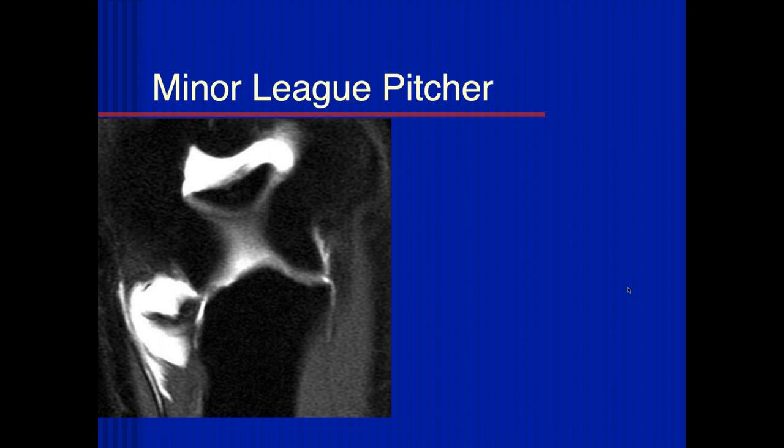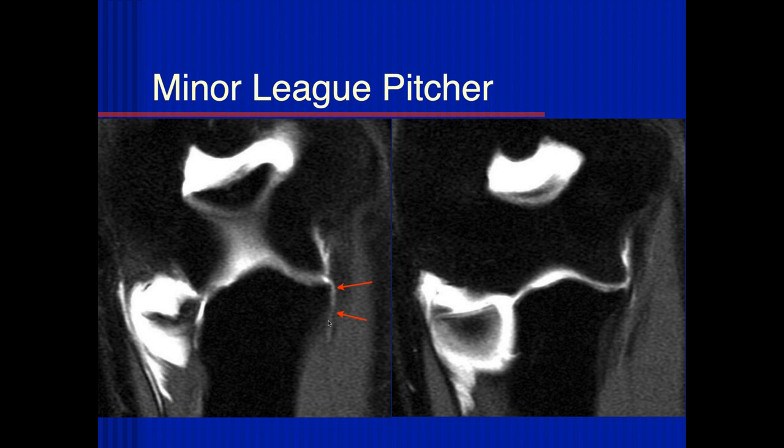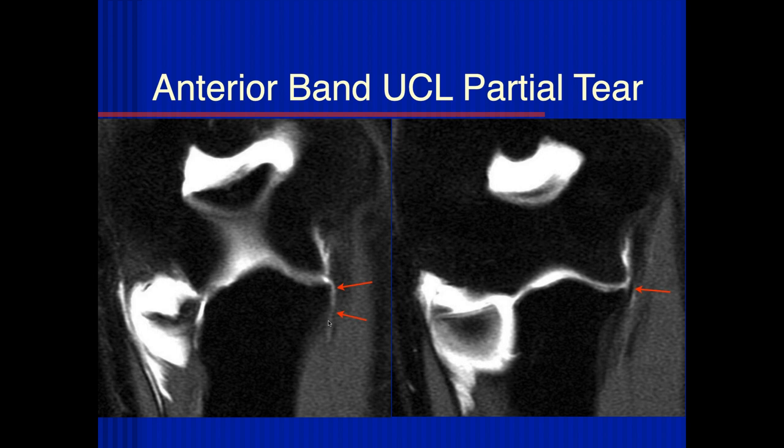Looking at the medial side here, it looks like there's some fluid between the sublime tubercle and the normal expected attachment of the ulnar collateral ligament. We're concerned for a partial tear — almost like a T sign here. It looks intact there, so I would say partial tear, anterior band, ulnar collateral ligament.